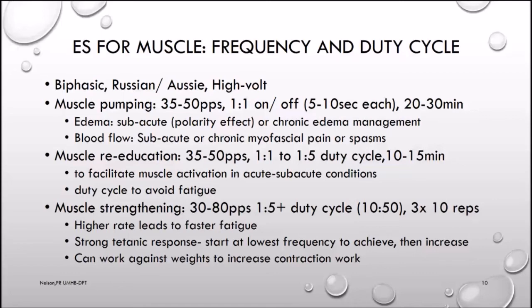The rationale that I would use for a muscle pumping would be to reduce edema in the subacute. I might use a polarity effect, or for chronic edema management. I'm also going to do this to improve blood flow in a subacute or chronic myofascial pain or muscle spasm situation. I can use muscle stimulation for muscle reeducation.